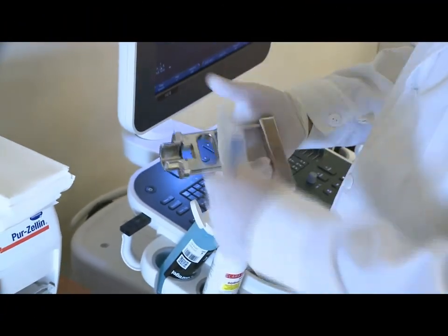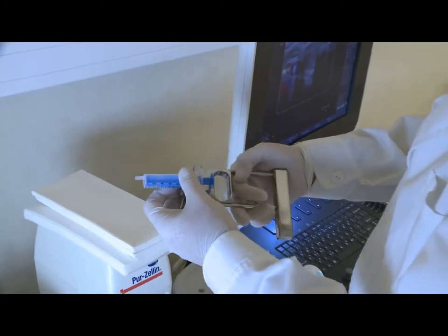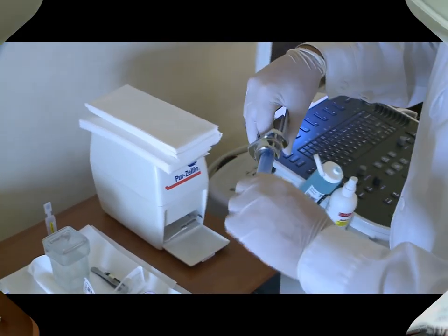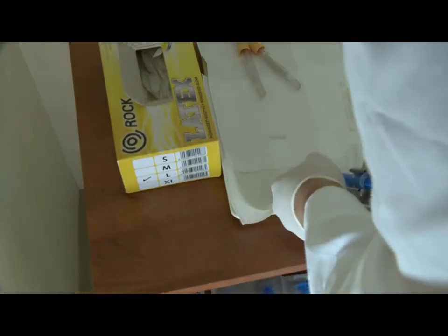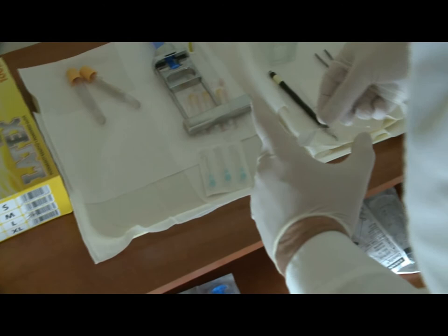Now I put on my gloves. It is important to insert the correct side of the syringe into the pistol — this will ensure that the needle fits into the ultrasound probe during aspiration. Now we insert the appropriate needle to the syringe. We have done the sampling and now we are preparing the smear: we spread the specimen onto the slide and smear with the use of another slide, then place the prepared smear into alcohol for fixation.